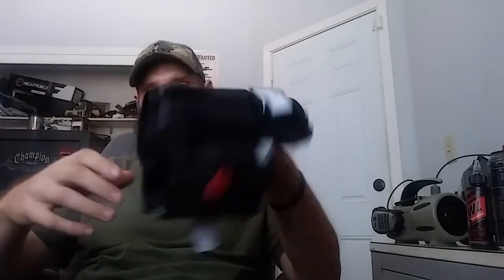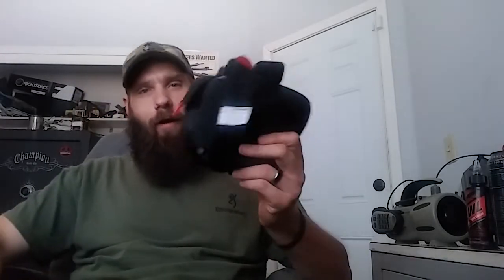But like I said, at this point, it's getting pretty big as far as the circumference, to get your pant leg over it and not look really conspicuous if you've got something shoved in there. But I mean, it's possible. You could even, if you don't want to put your CAT tourniquets here, put a single MOLLE attachment CAT holder. But definitely something to think about, so you can have this on your person.